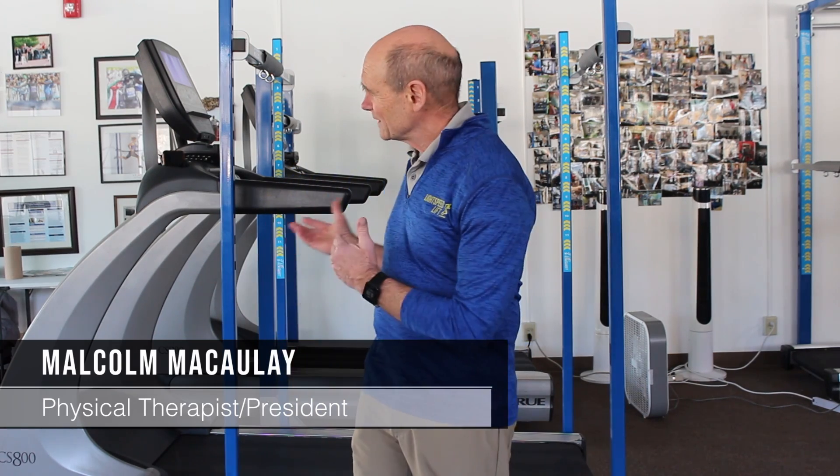Hello, I'm Malcolm McCauley, physical therapist in Duluth, Minnesota, developer of the Lightspeed Lift Body Weight Support System. We're here with tips and tricks on using the Lightspeed Body Weight Support System. Today's topic is overspeed training.